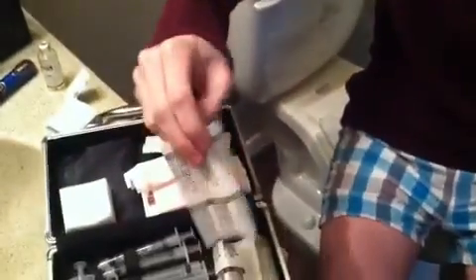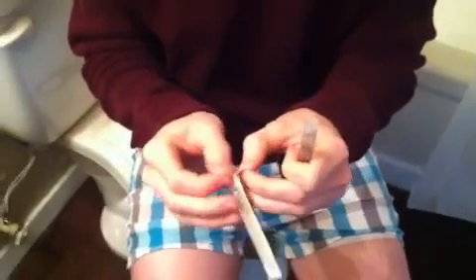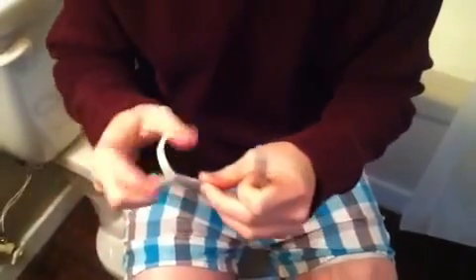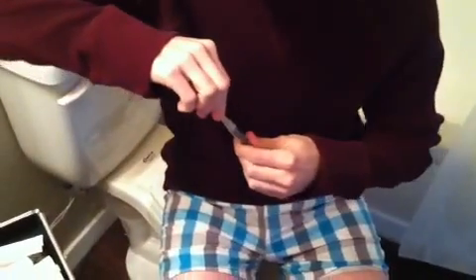Okay, this one is the one that I actually use to inject with. It's a 22 gauge, 1.5 inch needle, and lucky for me, I'm not a very big guy, so I don't have to put it in all the way. As you will see, I don't actually put it in all the way, just enough to get it in the muscle. And mine are intramuscular, and that does make a difference.